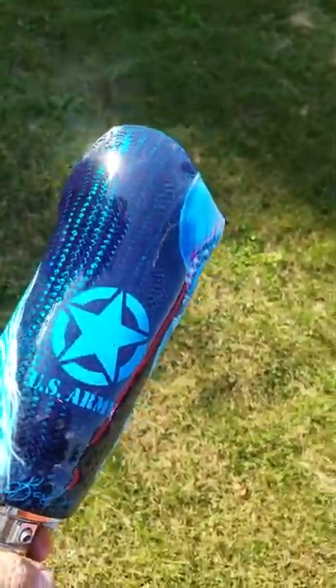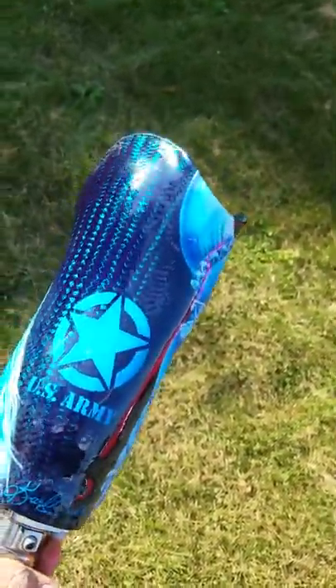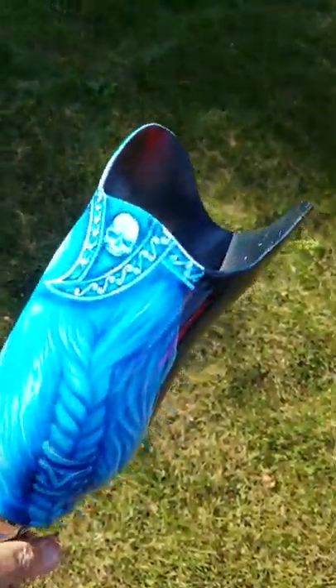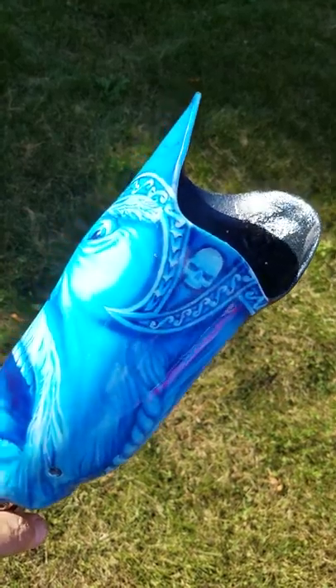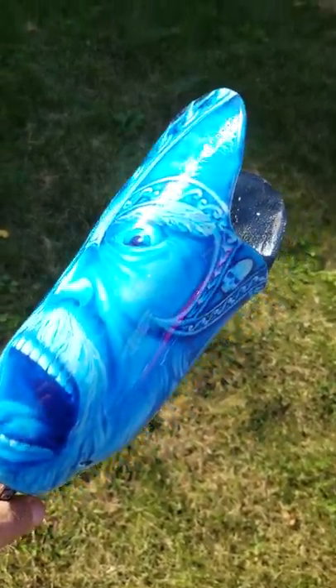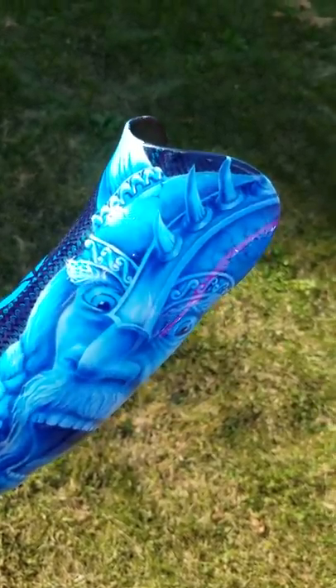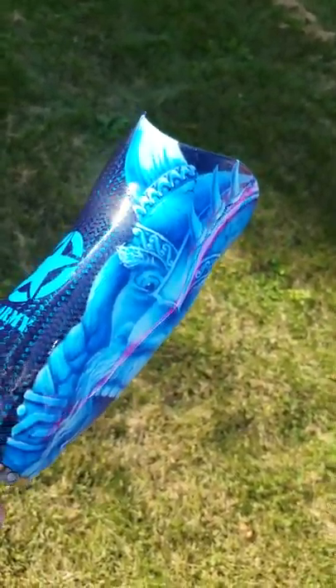This is the finished product for the oriental blue socket for the below-the-knee leg prosthesis, and it turned out really sweet. This is why I want to do custom paint for our wounded warriors.